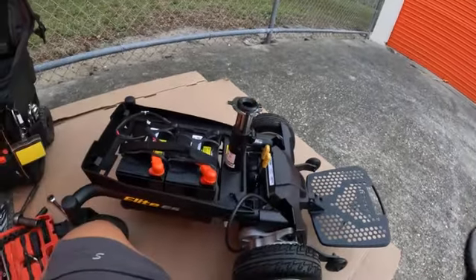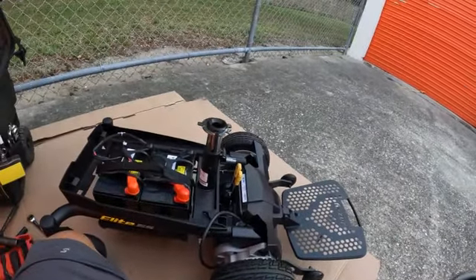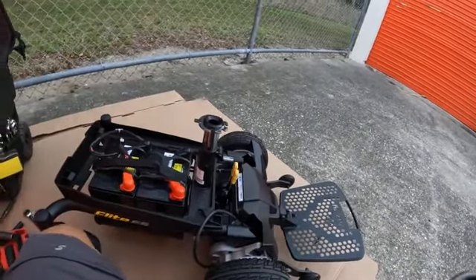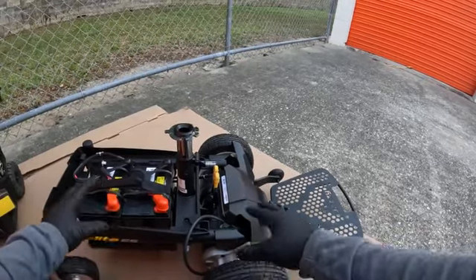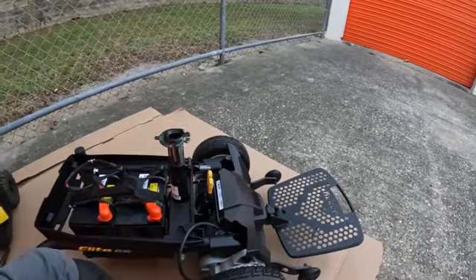Okay, so let's see, Jazzy Elite ES, how to replace motors on this unit. You don't have to strip it, but you have to take the seat off, the captain's seat, and then take off the cover, the shroud that goes right in here.